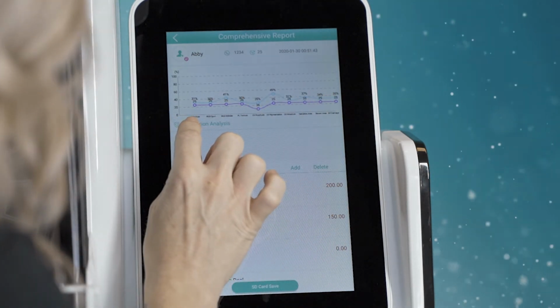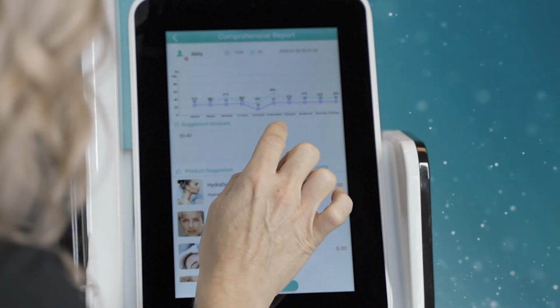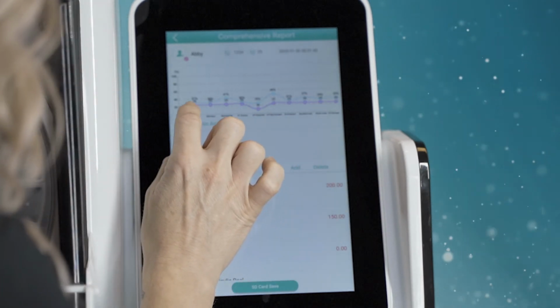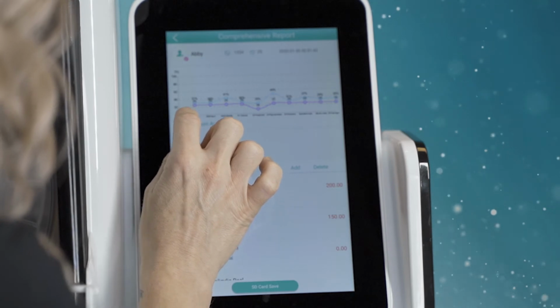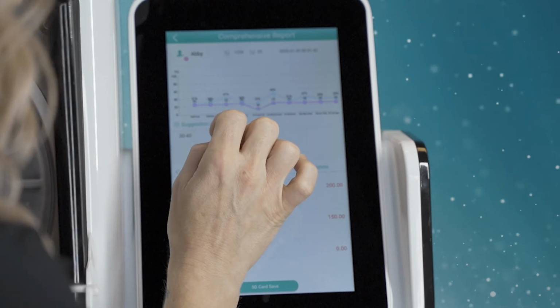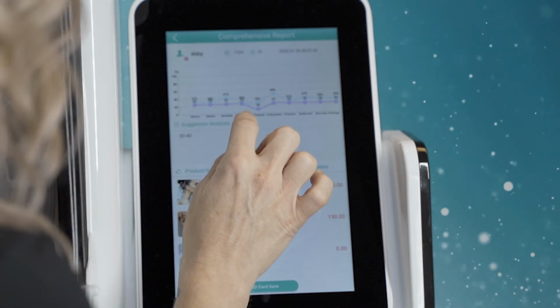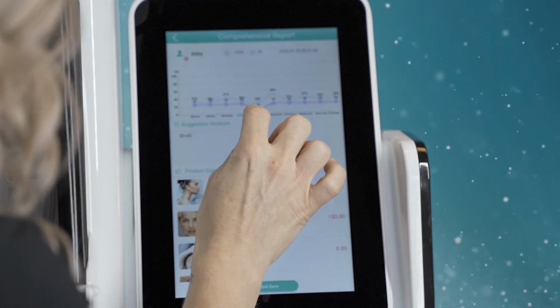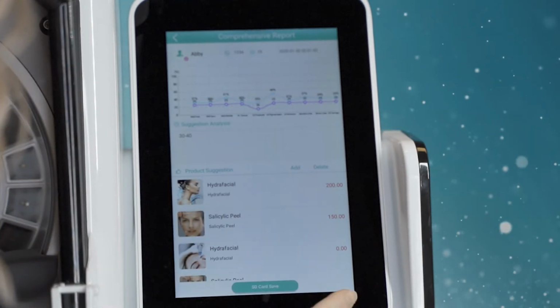You'll see on the bottom axis, it says pores, spots, wrinkles. These are the conditions it's scanned for. Our pink line is gonna be her skin age per skin condition, and then these percentiles. So it says for her pores, she's a 25-year-old at 31 percentile. Her age is 25, so that means she's right on point. Her porphyrins, however, are a little bit lower. They're a little bit poorer. So she's actually at a 26-year-old average for those porphyrins.